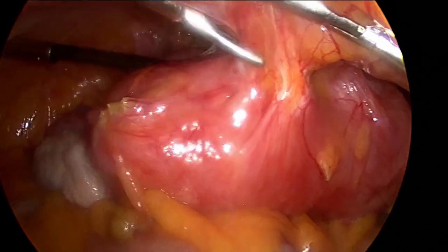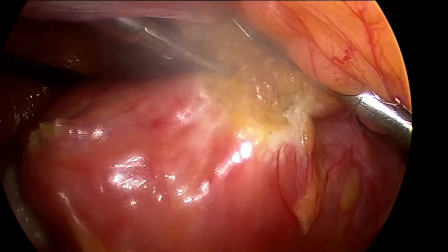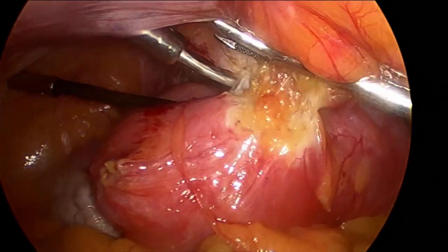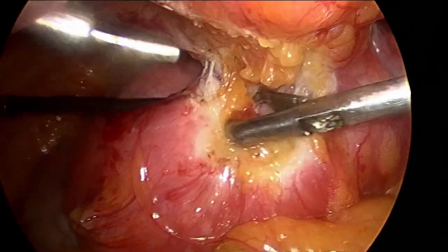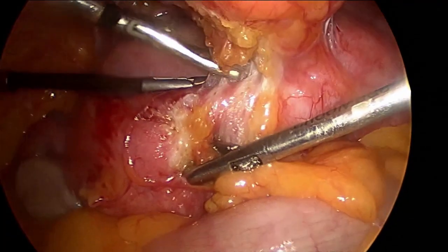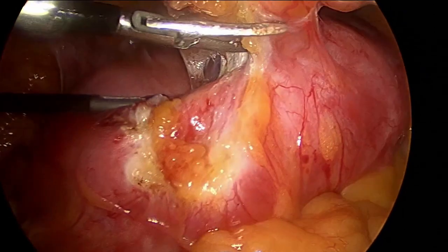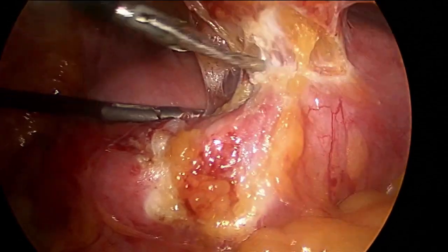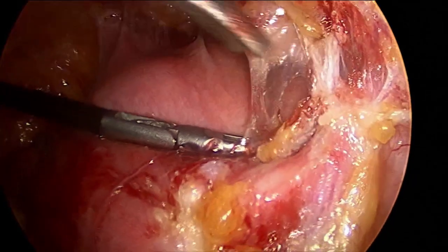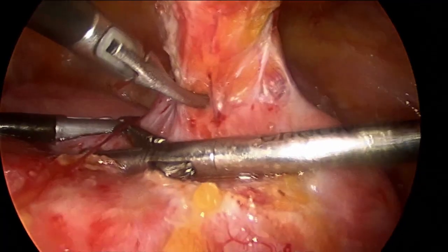Now we proceeded for the anterior adhesion band. We used the bipolar shears with the sharp cutting current, remaining near the uterine surface, taking care that uterine tissue should not be left behind along with the anterior abdominal wall. Little by little the band was released, with traction made using the needle holder and grasper, until the adhesion band was released completely off from the uterine surface.